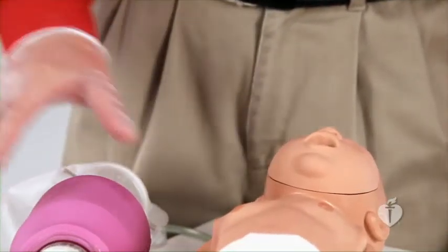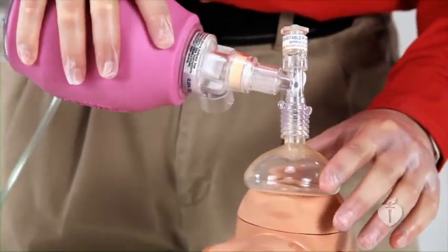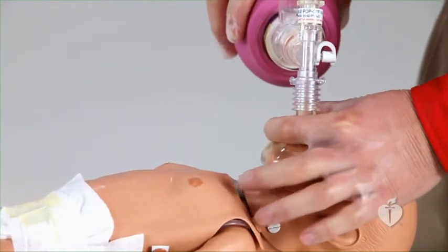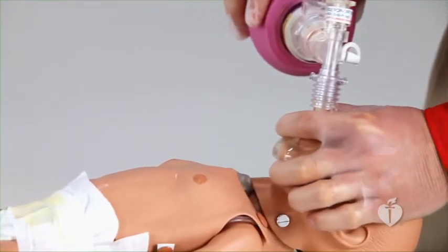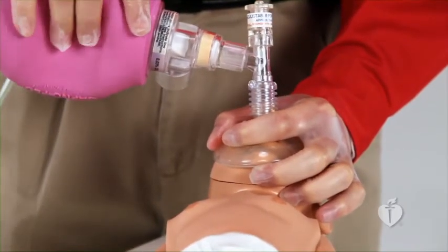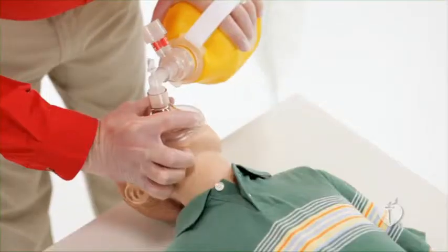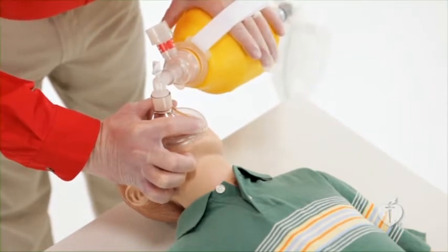On an infant mannequin in the practice station, the technique looks like this. Position the victim. Apply the EC clamp technique. Open the airway. Squeeze the bag slowly. Observe for chest rise.